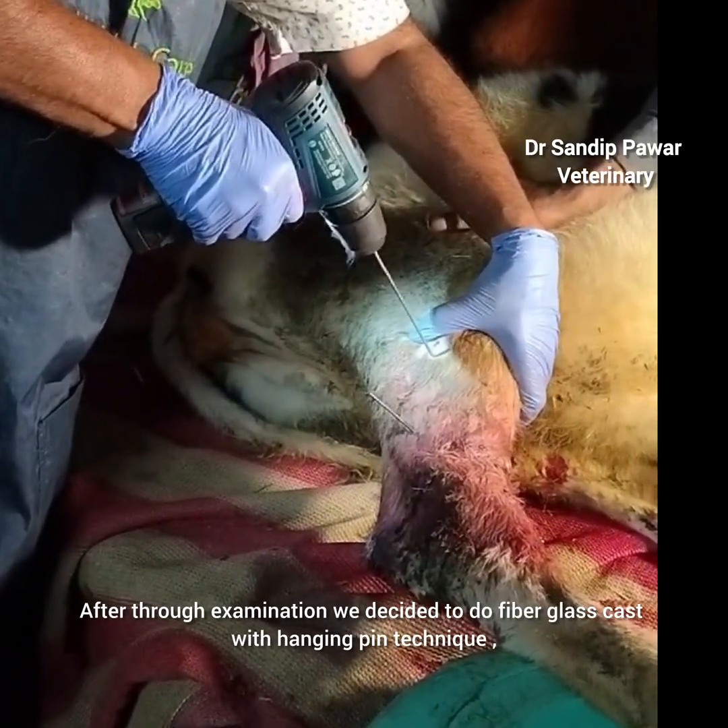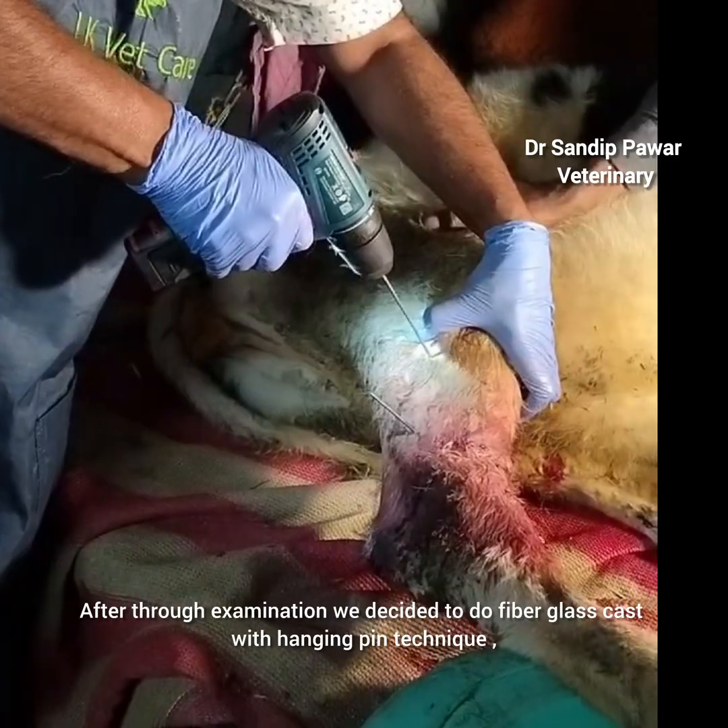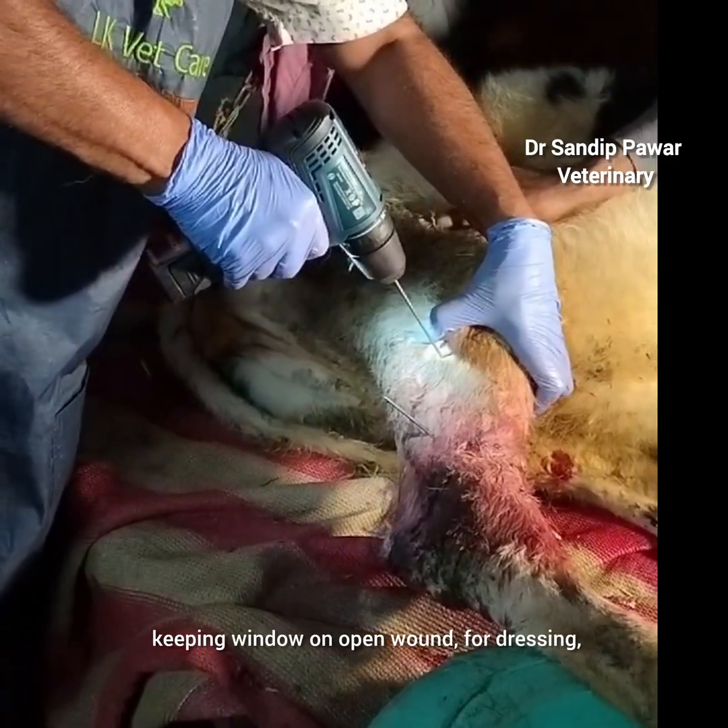After thorough examination, we decided to perform a fiberglass cast with a hanging pin technique, keeping a window on the open wound for dressing access.